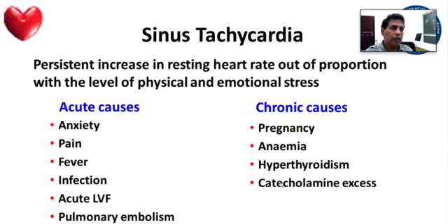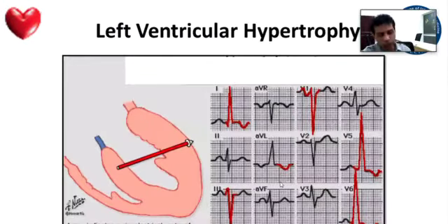Now quickly, a couple of conditions that you might see often in ECGs and that are important to diagnose if possible. One is LVH. Remember, ventricular dilatation, either left or right, cannot be diagnosed by an ECG. We can diagnose atrial dilatation, left and right, which I am going to talk about today. But we can diagnose hypertrophy. Hypertrophy is not dilatation. Hypertrophy is increasing muscle mass and thickening the muscle wall.